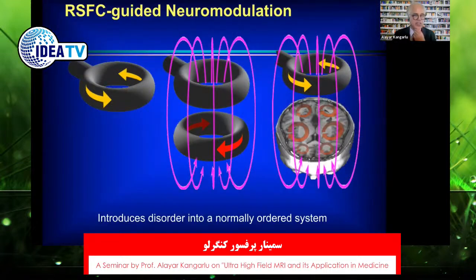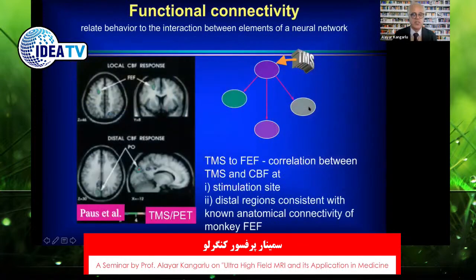And the way I'm using resting state functional connectivity, in our group, is to guide some neuromodulation, some modifications that we can induce in certain regions, in certain misbehaving nodes or abnormally active members of the network. By modulating them, we can even reach deeper lying nuclei, which are not accessible by techniques such as transcranial magnetic stimulation.